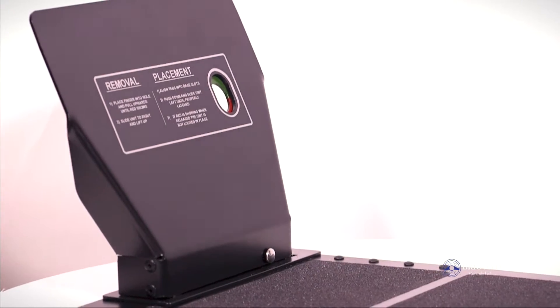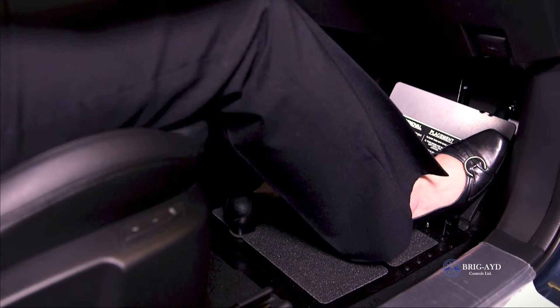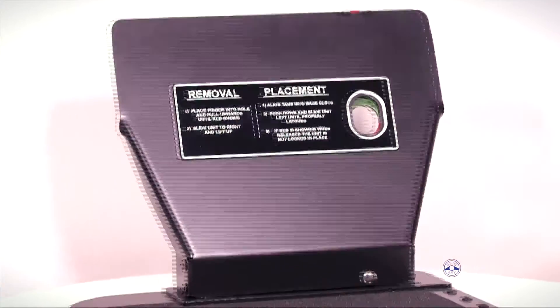We are introducing the Brigades floor-mounted pedal guard. The system stops the accidental operation of the pedals. It also prevents the trapping of the feet or prosthetic limbs under the pedals when driving with hand controls.